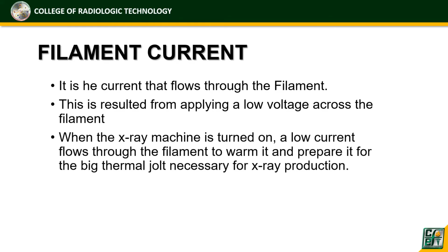When the X-ray machine is turned on, a low current flows through the filament to warm it and prepare it for thermionic emission. So kapag binuhay daw natin ang X-ray machine, may dadaloy ng mababang voltahe sa ating filament upang ito ay mag-warm up para din sa preparation nito sa tinatawag nating thermionic emission. Remember that thermionic emission occurs when the filament is heated up to more than 2000 degrees Celsius. And thermionic emission is necessary for X-ray production.